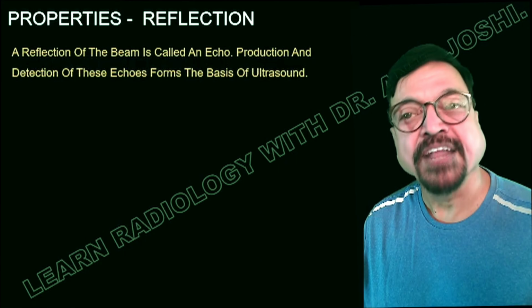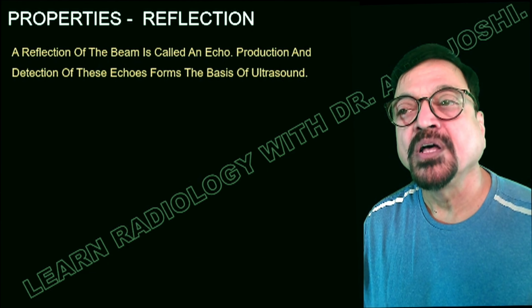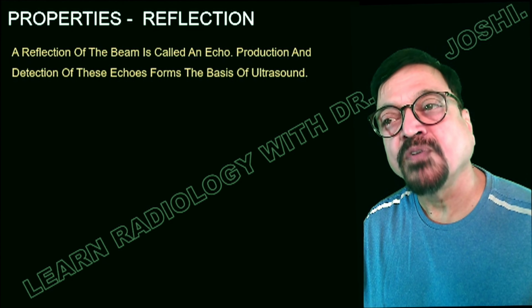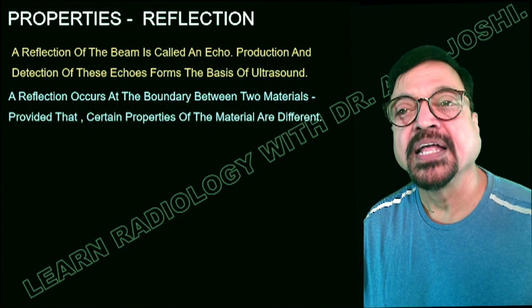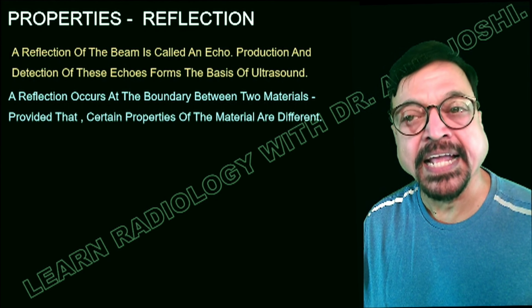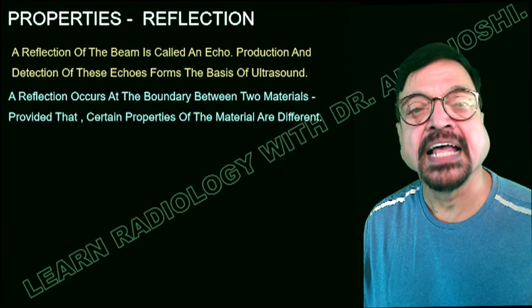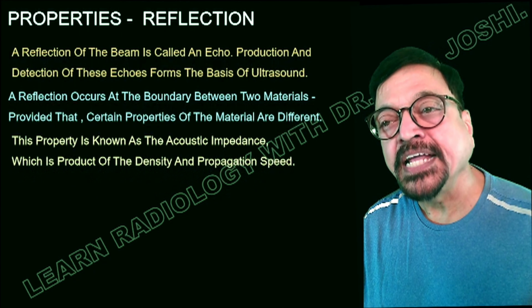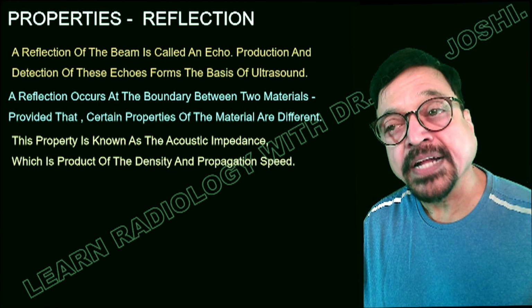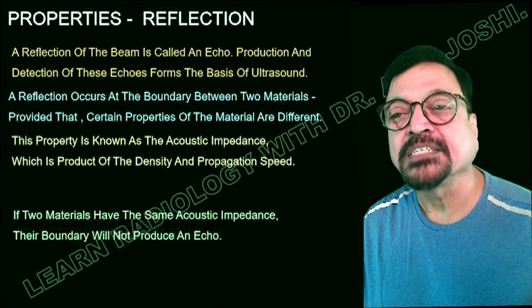First is reflection. A reflection of the beam is called an echo. Production and detection of these echoes form the basis of ultrasound. A reflection occurs at the boundary between two materials, provided that certain properties of the materials are different. This property is known as acoustic impedance, which is a product of density and propagation speed.